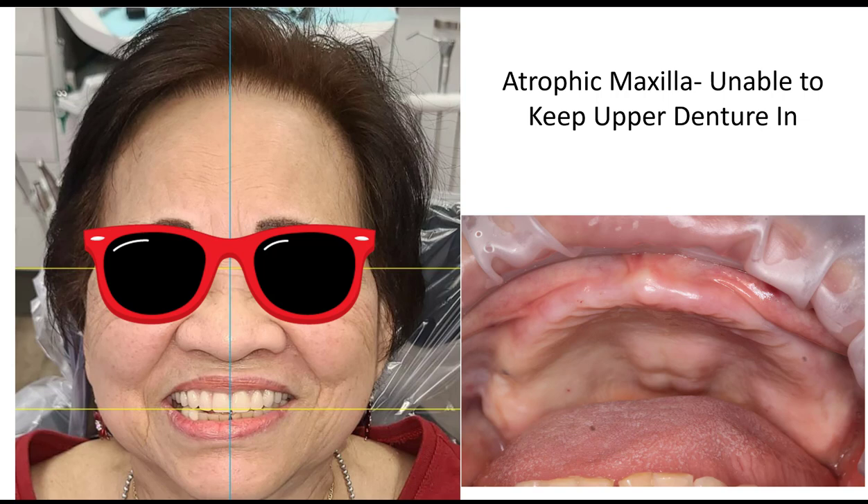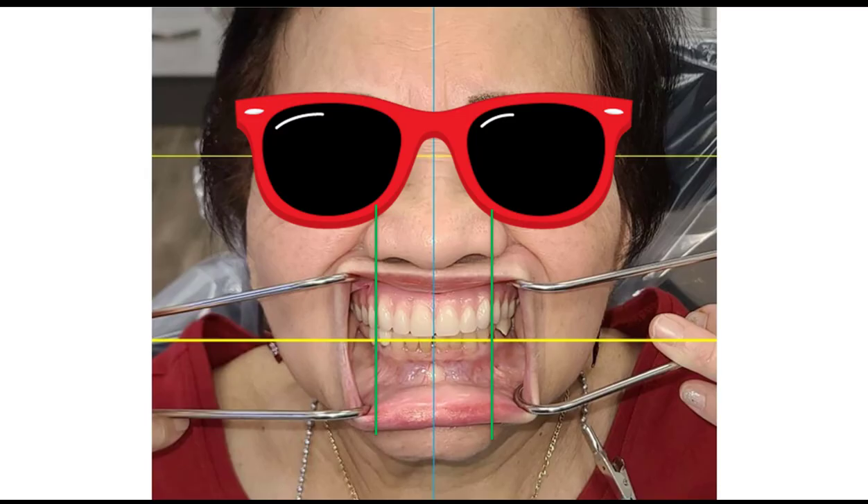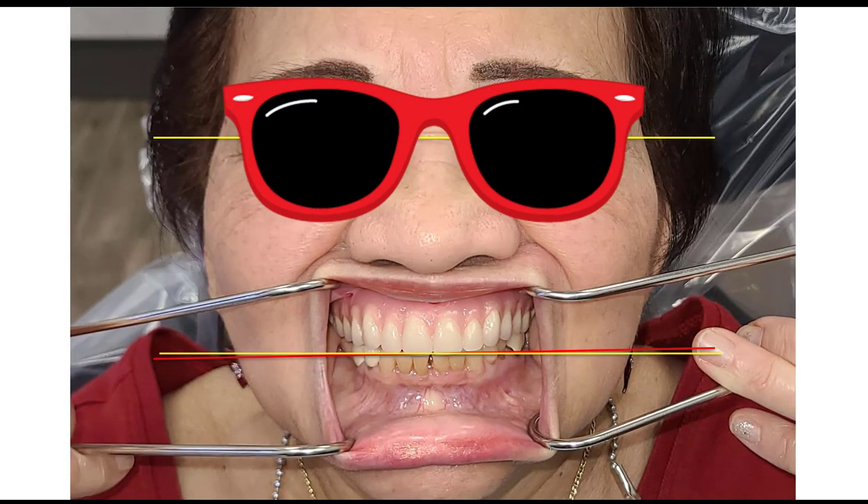You can see the facial analysis I've done — we've got the facial midline, her interpupillary line, and I've pulled that same line down to evaluate her incisal edges and the cants. I always try to evaluate the smile critically before starting these cases, because anything we place as implants, we actually have to restore. We want ideal teeth before we start placing implants. He made my job easy because we had such a good denture to start with. The canine-to-canine width is perfect; however, there's about a one-degree cant heading uphill to her left compared to the interpupillary line. The yellow line is the interpupillary line translated down, and the red line is the current cant — literally one degree off.